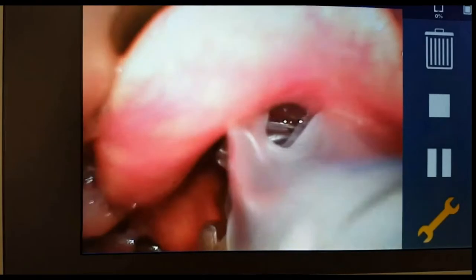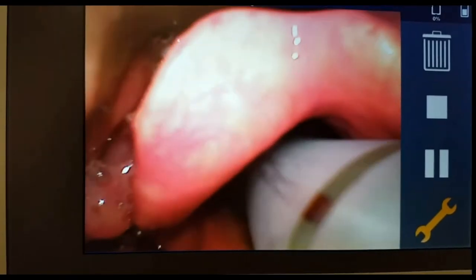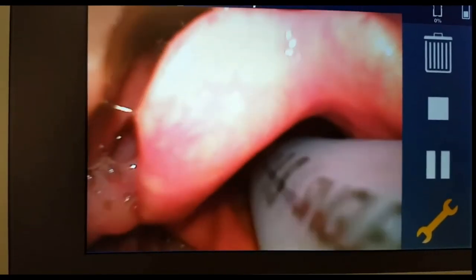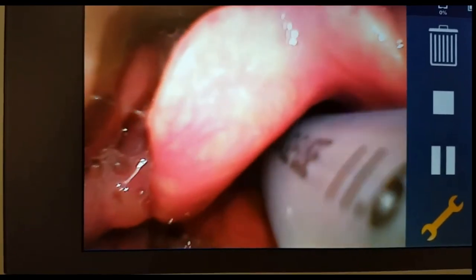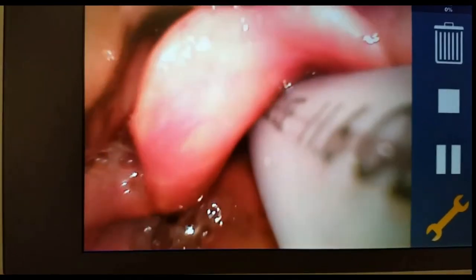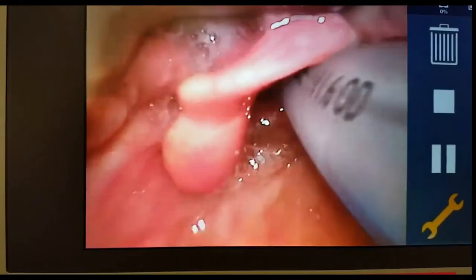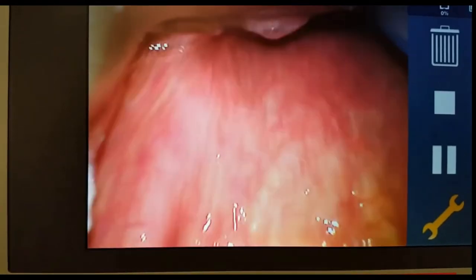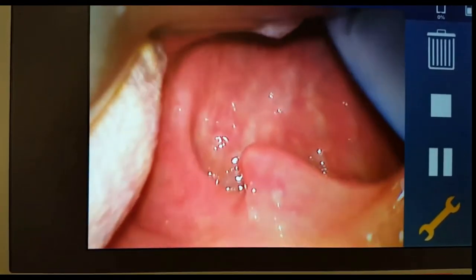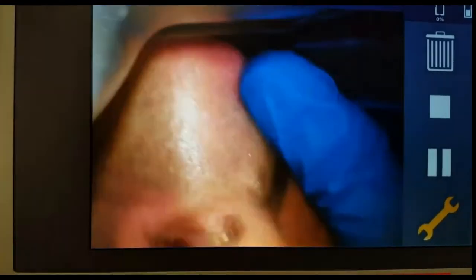This is the endotracheal tube, and that is the black depth marker line that has just passed through the vocal cords, which means we are satisfied that this patient's intubation is complete. Let's go through this once again.